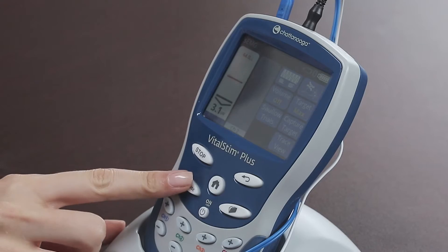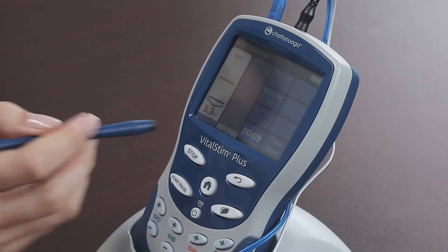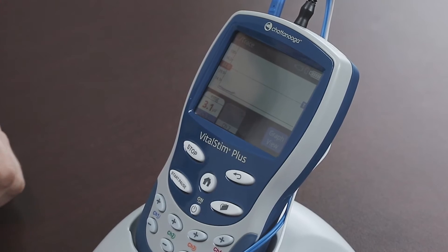You're now ready to start working the session with your patient. Press start/pause to start recording the session data and ask the patient to contract in such a way as to exceed the threshold. You can do this in graph view or switch to trace view, which tends to be easier for the patient to work with.